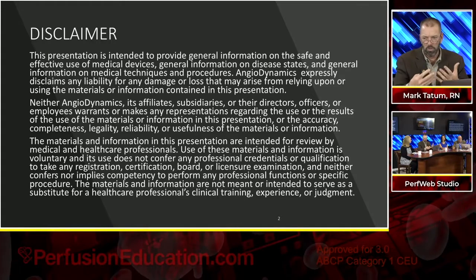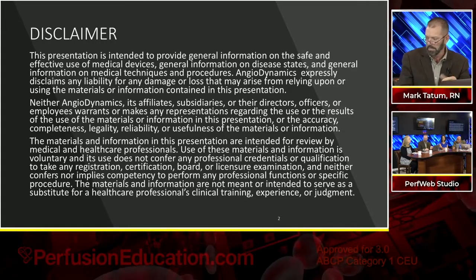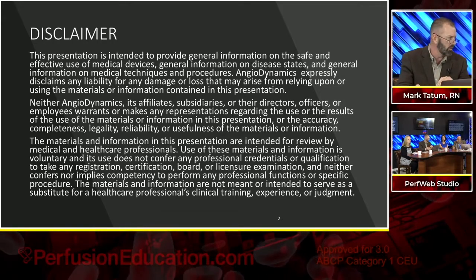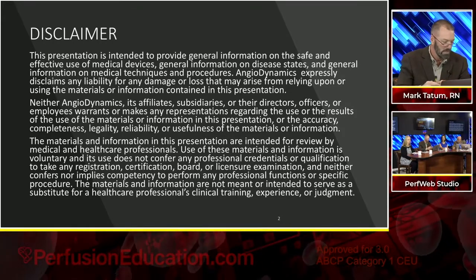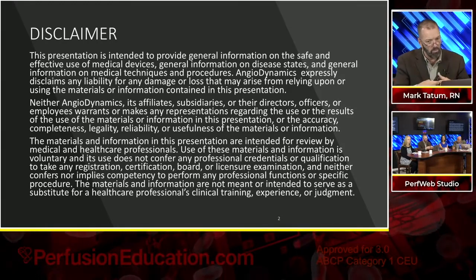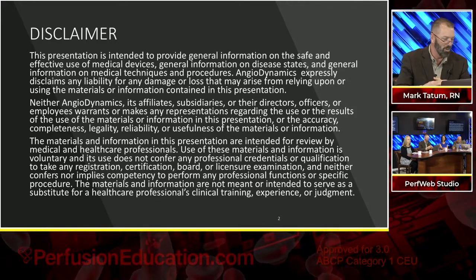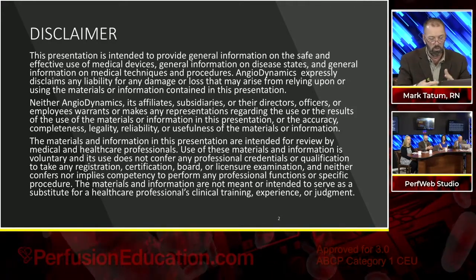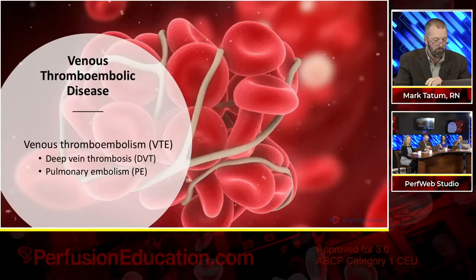But as most of the audience will understand, we're predicated on a venous drainage cannula. Clearly, you wouldn't normally put a venous drainage cannula in a place that has a significant amount of blockage. You wouldn't be able to get it to do its job. So, because of our predicate device, that is what's on there. It is an understanding, however, that we are going to be working in areas of undesirable intravascular material or our newer indication, fresh or soft thrombi or emboli.